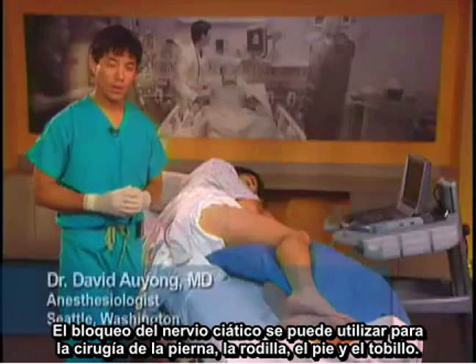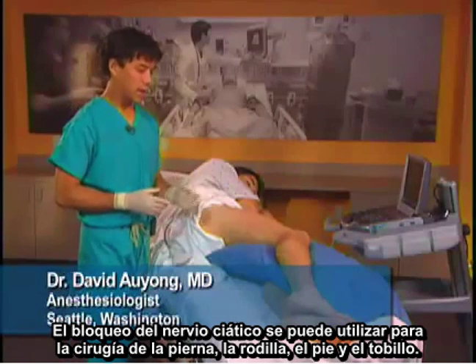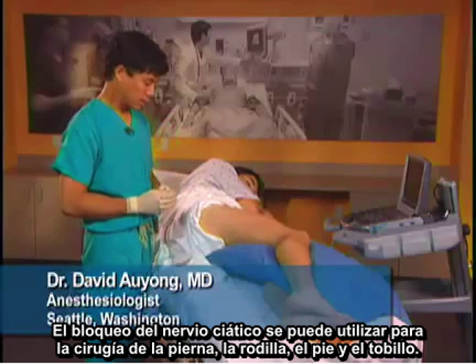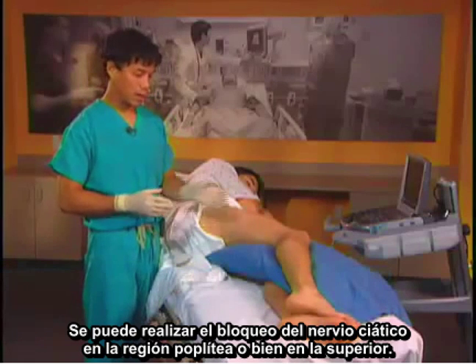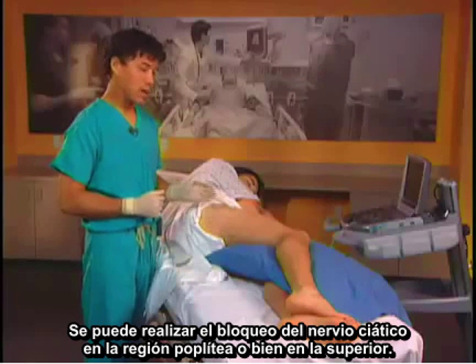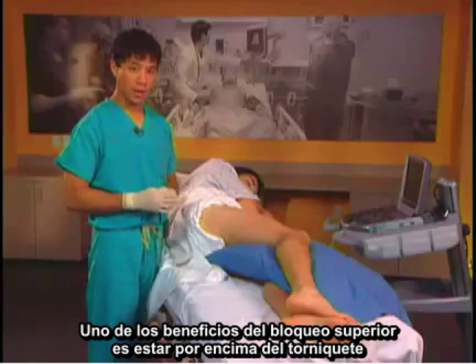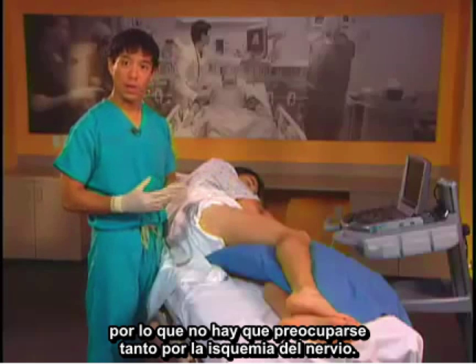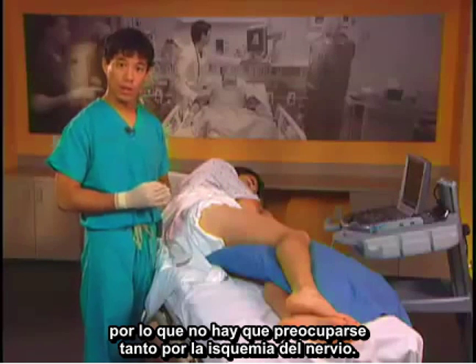The sciatic nerve block can be used for surgery of the leg, knee, foot and ankle. To do the sciatic nerve block you can block it at the popliteal region or you can block it higher. Some benefits of blocking it higher are to be above the tourniquet so you don't have to worry so much about nerve ischemia.